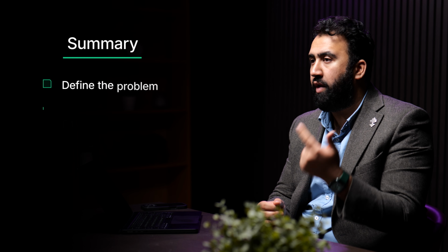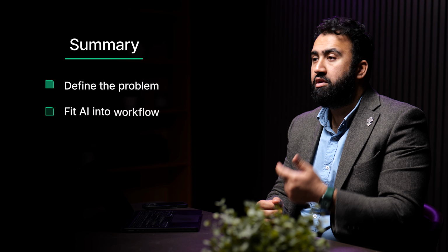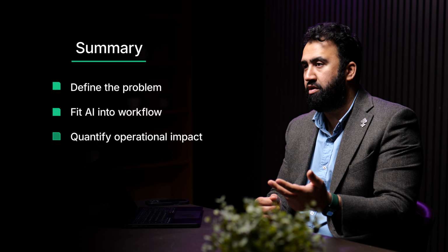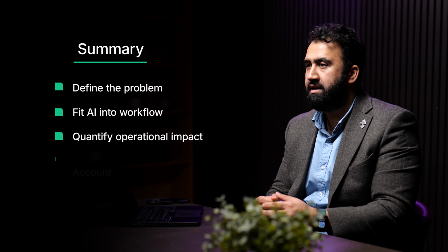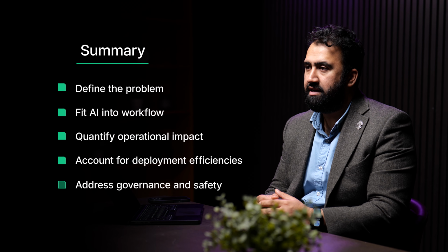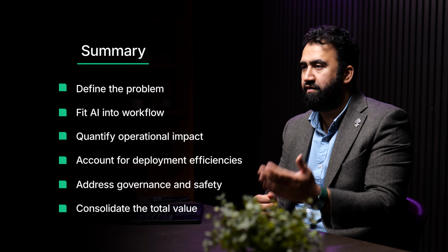So to summarize, the key ingredients of an AI business case, using chest X-ray AI as an example: define the problem clearly, show how the AI fits the workflow, quantify the impact on turnaround time, backlog, overtime costs, reporting capacity, account for deployment efficiencies, highlight governance and safety, and present a clear, consolidated view of value.